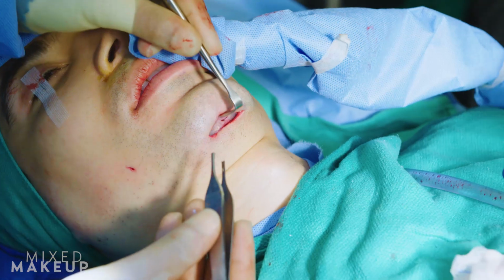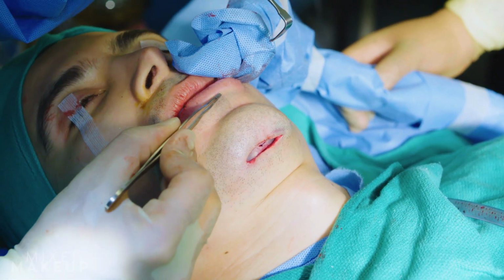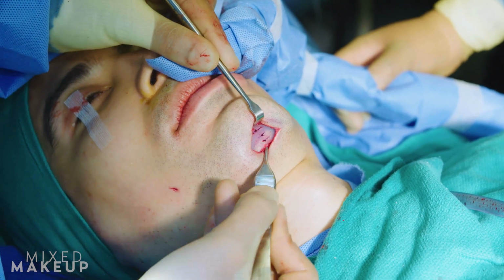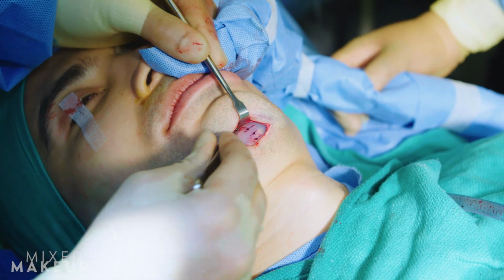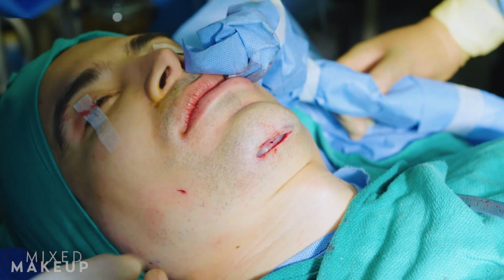All right, so here is the chin implant portion. It's connected right in the center. I had a dot right here at his midline, and if you can see straight down, it's right where it matches. It's sitting in that protuberance. It's locked into place. The sutures I just meant to make sure that's reapproximated. That little notch that I made, it's like a jigsaw. It's fit right in. So we are done with that portion.